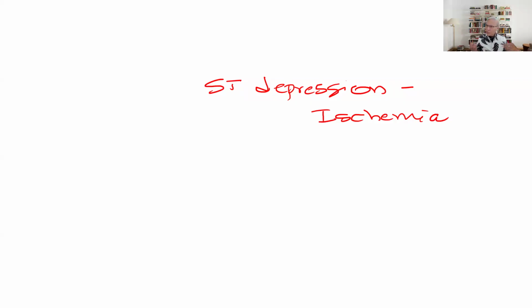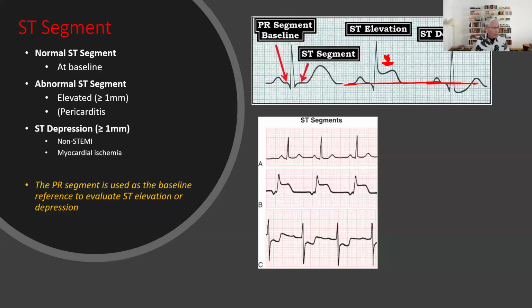All right, patient comes in the emergency room complaining of chest pain. If the patient is having an MI, which finding are you most likely going to see? It's going to be an ST elevation. So I hope that you understand that, right?